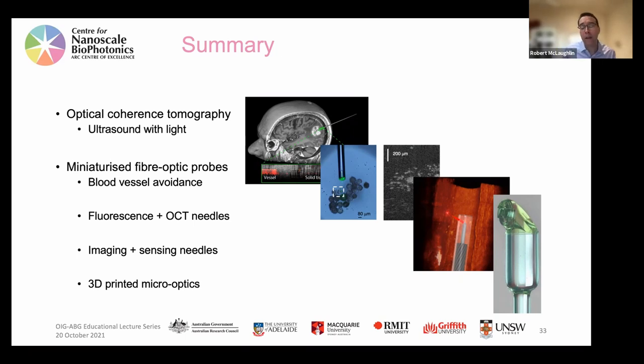In 3D printing it works really well, but there is a mixture of those that sort of catch you on the edges. And I think the message here is that when you use that higher caliber of 3D printing, because you're printing things at the scales of wavelengths of light, the details really do matter. Whereas for other 3D printing, like your much larger scale stuff, it's a bit more rough and ready and doesn't matter so much.